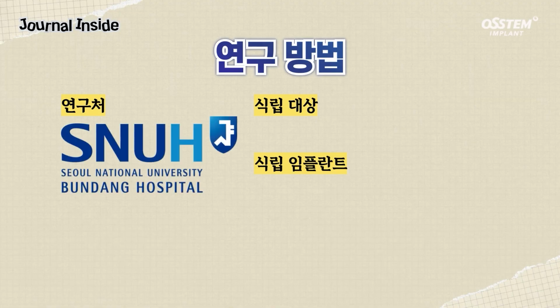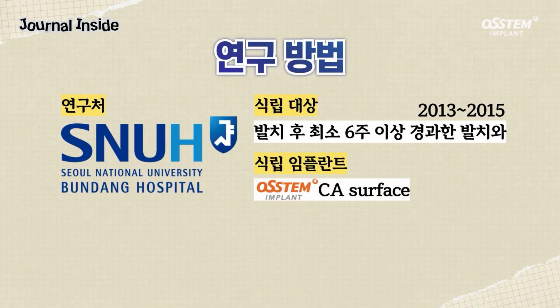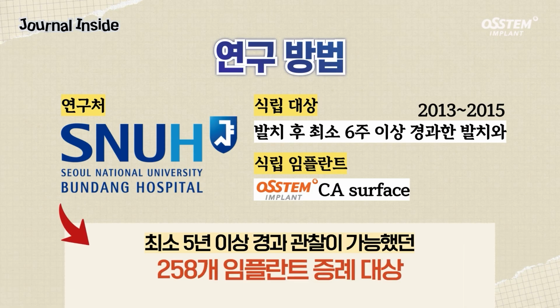First, let's check the methodology. At Seoul National University Bundang Hospital, OSSTEM CA implants were placed on patients at least 6 weeks after extraction from 2013 to 2015, and 258 implant cases where at least 5 years of progress observation was possible were selected as a target.